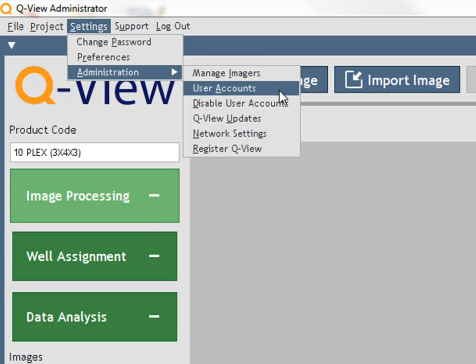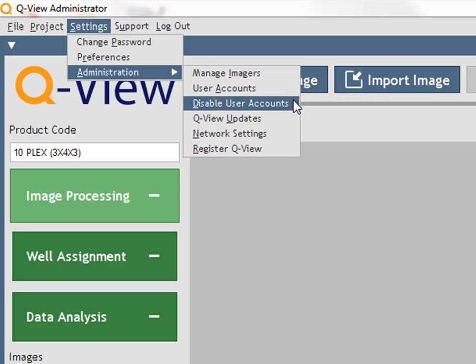User accounts lets the administrator create, delete, or edit user accounts and passwords. Disabling user accounts will make logging in no longer required to use QView.